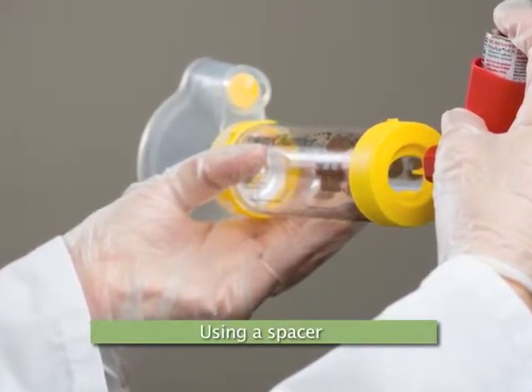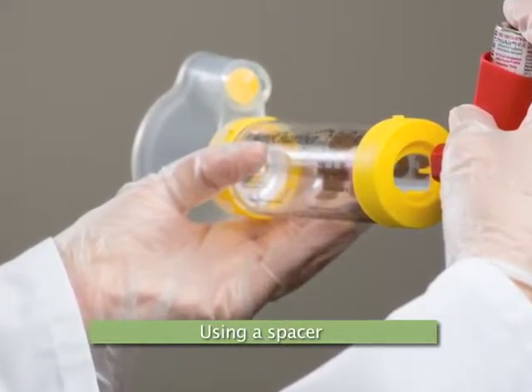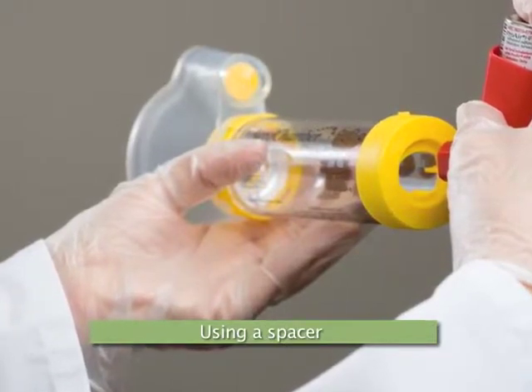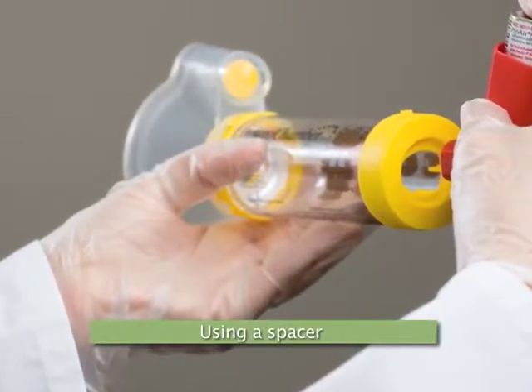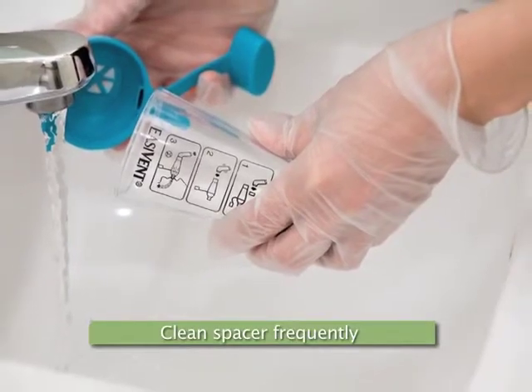The resident breathes out, away from the spacer, then inserts the spacer mouthpiece into the mouth. The inhaler device is pressed once, and the resident takes a deep breath in, holding it as long as possible. Only one puff at a time can be sprayed into the spacer. Remember to clean the spacer frequently according to facility policy.